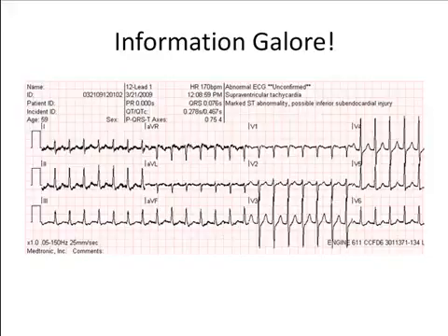Finally, the PR interval. Normal is 0.12 to 0.2 seconds. Anything longer, look for a heart block. Put little faith in the machine-generated interpretations and trust your findings.